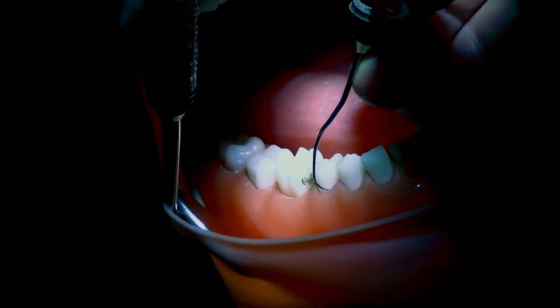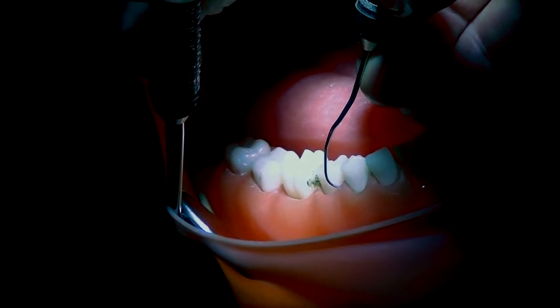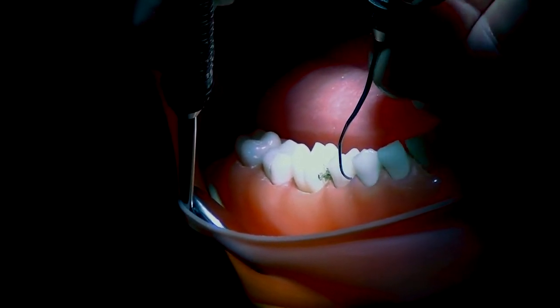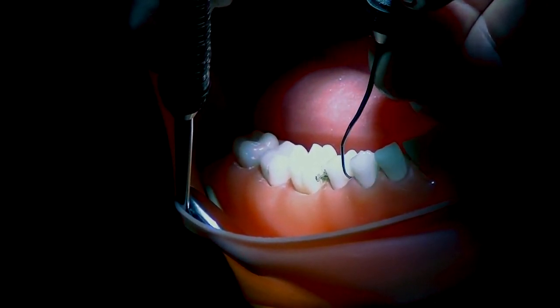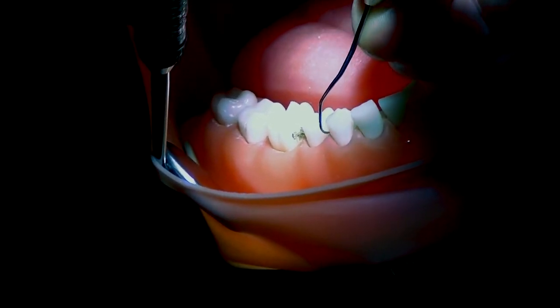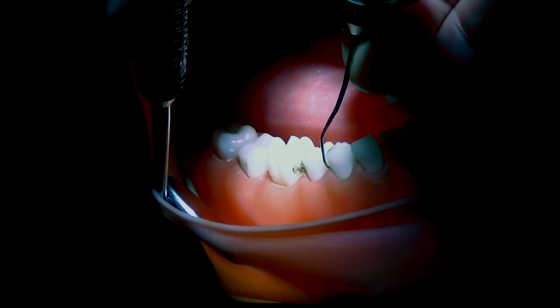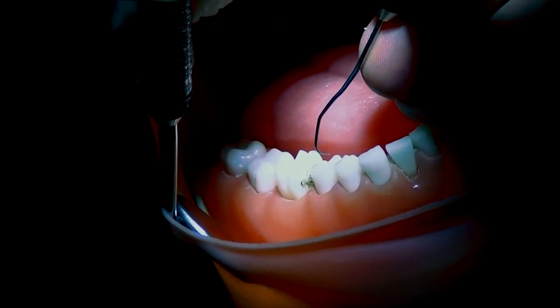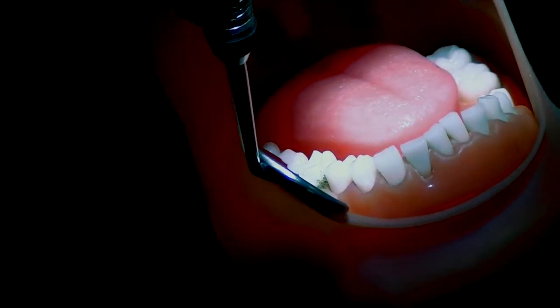Coming around to the mesial line angle of the tooth, staying at the bottom of the pocket all the way. Go to the midline of the tooth, and then work your way up under the contact, and then facial to the contact. That's how to explore a posterior.